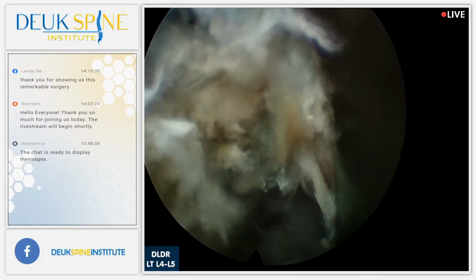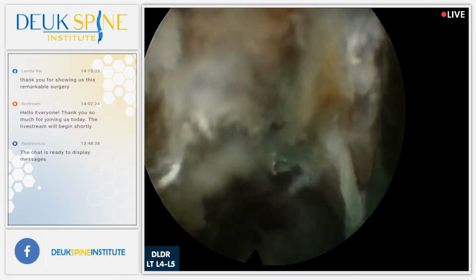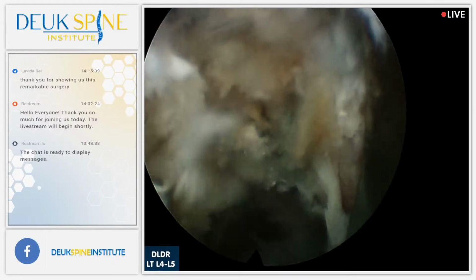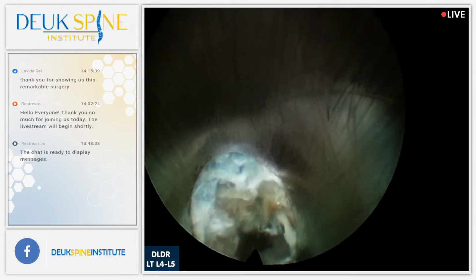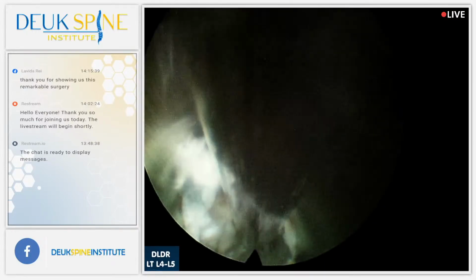Luis, scrub out. All right, let's see the grabber one more time. Yeah, keep that fiber sterile. Any questions while we have the opportunity right now?